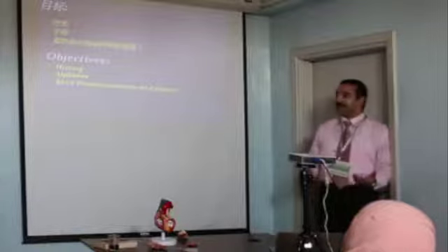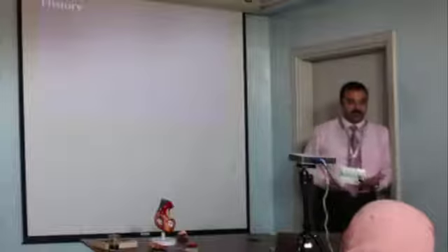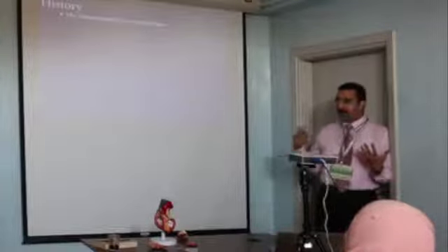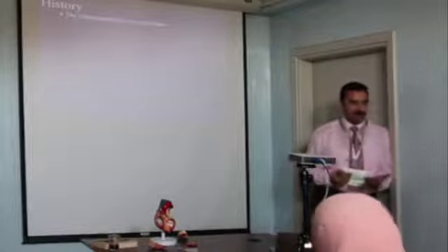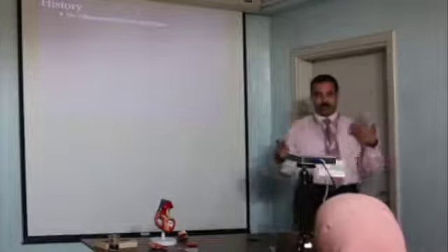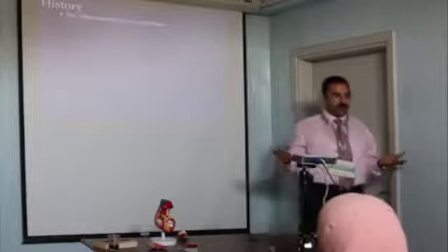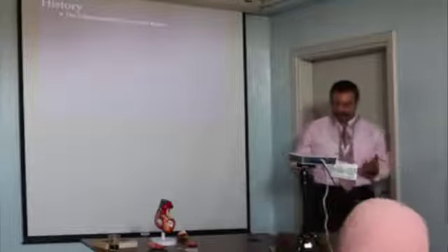Yes, this is what I mean when we were discussing ultrasound in lung for ages. Ultrasound was not for lung by sonographers. They cannot assess anything in the lung because the ultrasound hits air and bone, and what's in the lung is just air. This is the normal lung.